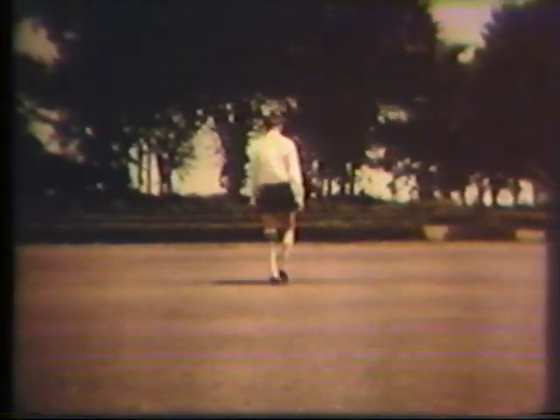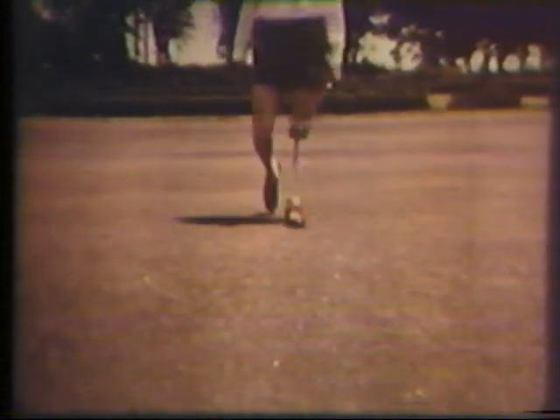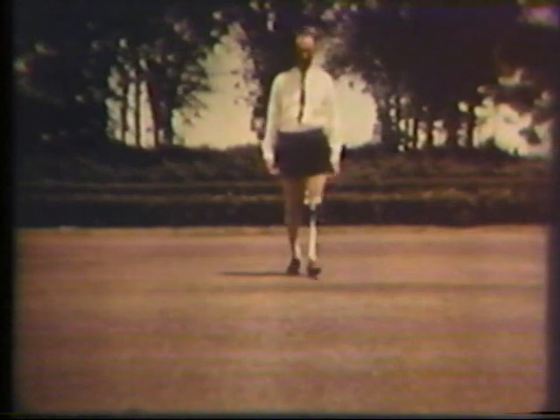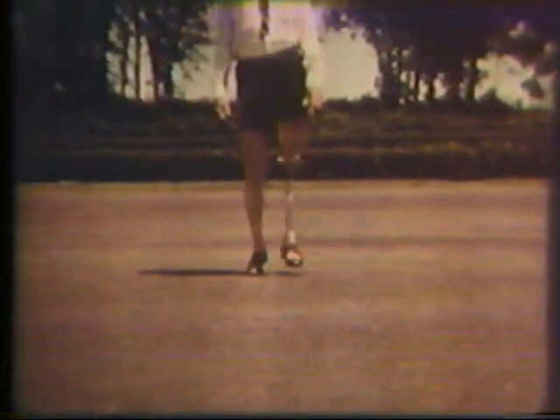This is an excellent demonstration of vaulting. Notice the way in which the weight is held on the anterior portion of the normal foot, the body elevated, and the prosthesis then lifted through. Damage to the normal foot can result, excessive fatigue is common, and the expected walking speed is never achieved. Time is involved in these excessive movements as well as expenditure of excess energy. It is a very common habit pattern which may carry over from a patient converted from shoulder harness to pelvic belt or suction suspension, and may also be seen in those with poor balance or inadequate voluntary knee control. Elevation of the trunk on the normal forefoot permits the patient to swing the prosthesis through with less than desirable knee flexion.